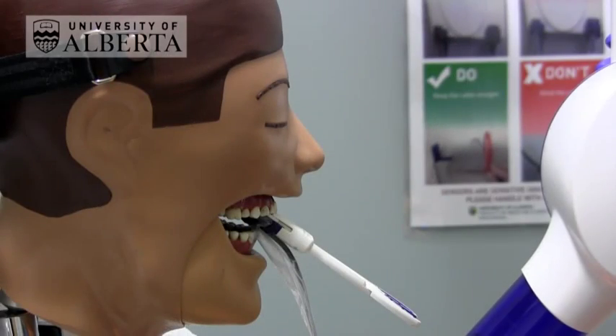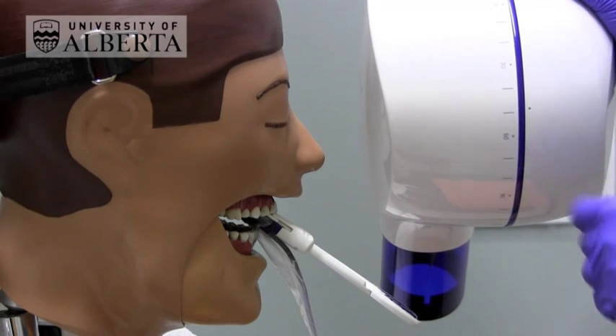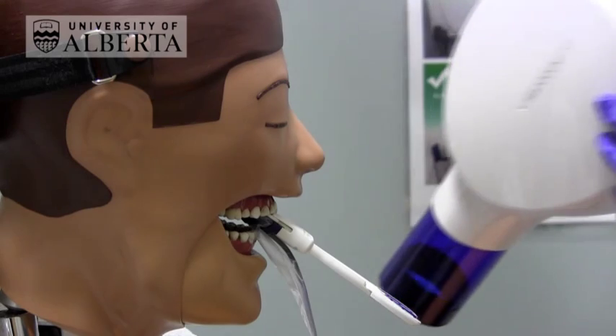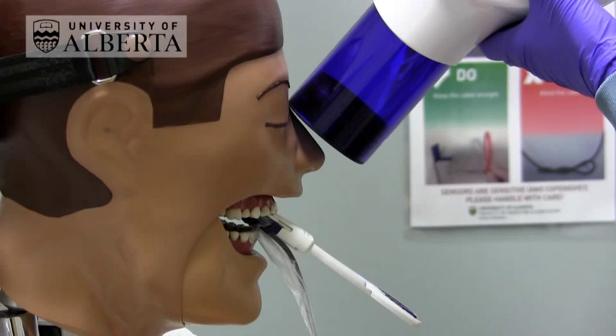As a good starting point for the vertical angulation of the upper incisors, use an angulation of about plus 40 or plus 50 degrees. Then align the aperture over the teeth of interest.